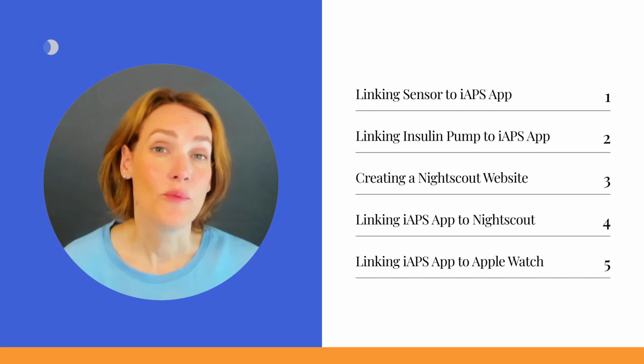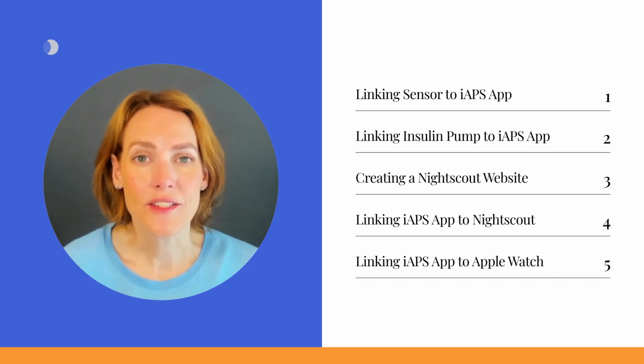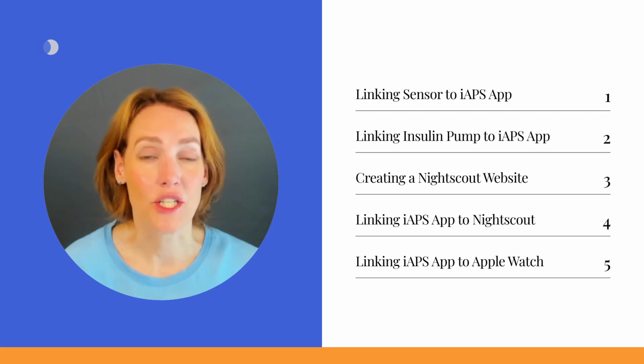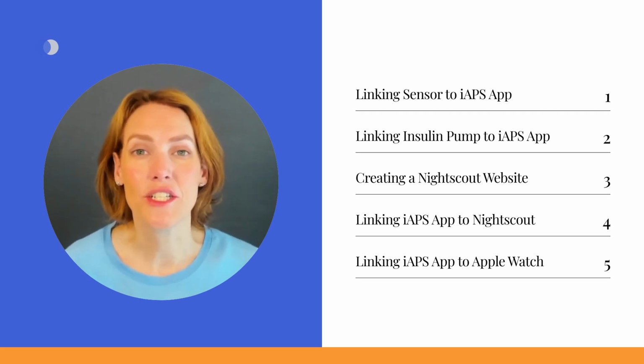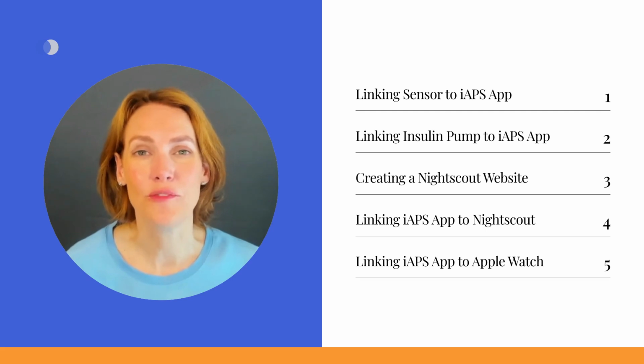In this chapter, we explored the different connections available in iAPS. From glucose sensors to insulin pumps and Nightscout, these links enable seamless communication for effective diabetes management. By establishing these connections, users can fully leverage the capabilities of iAPS and take control of their diabetes.